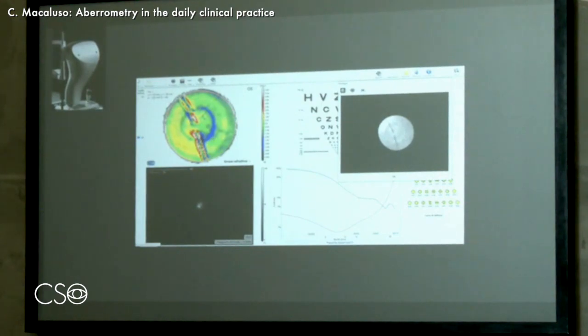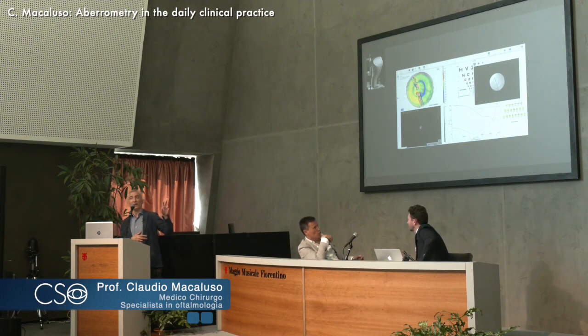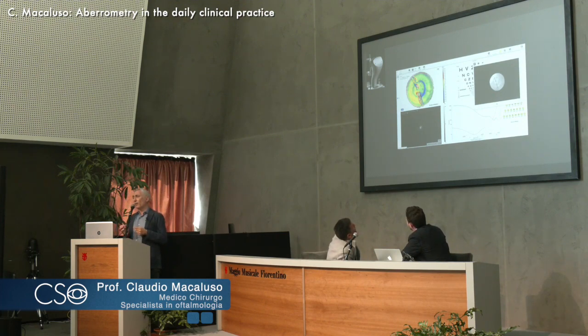On the right panel, I think you can appreciate the retroillumination picture, with the IOL in there as something strange: it is an Alcon VVT IOL, so it has different concentric refractive areas. But we can also see this opaque line; those are little faults in the capsule. They're not a major issue.